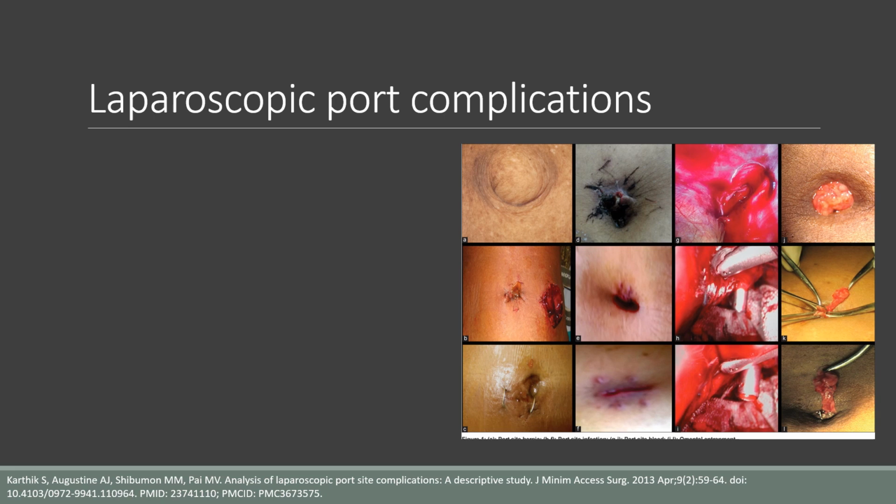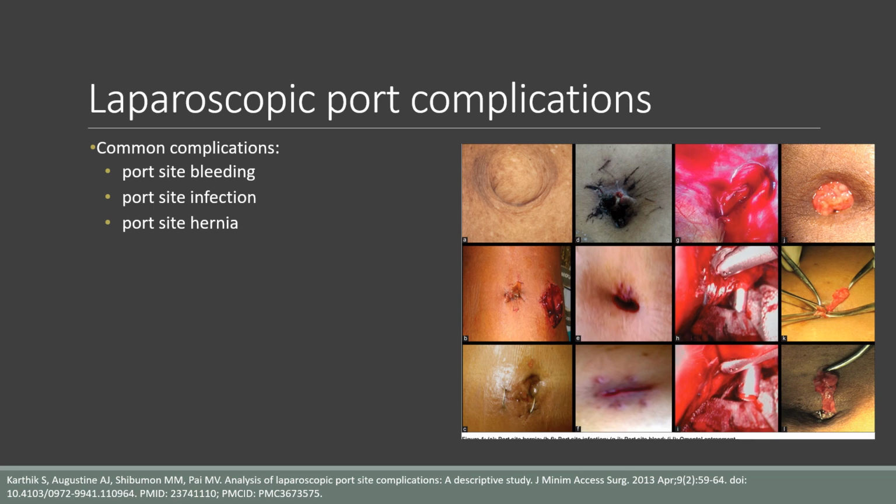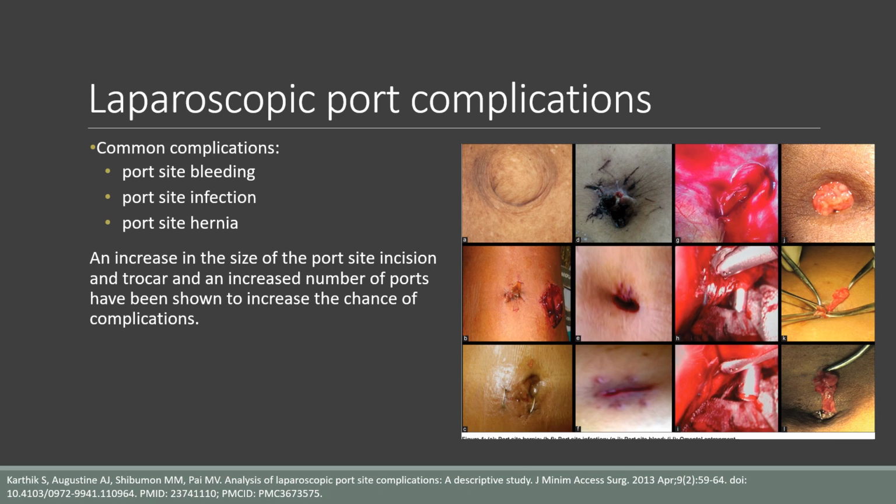I briefly touched on this in the previous slide, but sometimes we can get laparoscopic port complications, and some of these complications include port site bleeding and port site infection. You can get port site hernias, and an increase in the size of the port site incision and trocar, and an increased number of ports has been shown to increase the chance of complications.